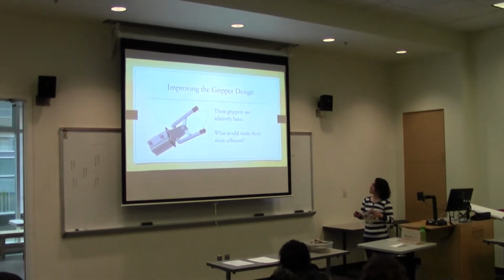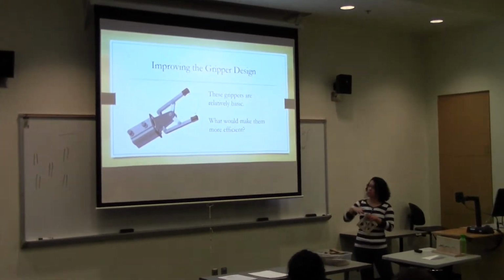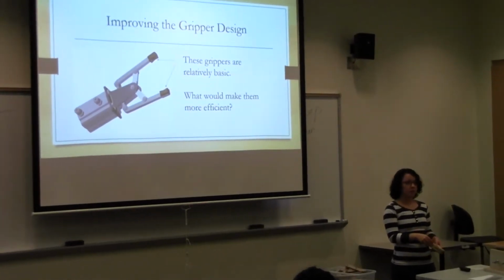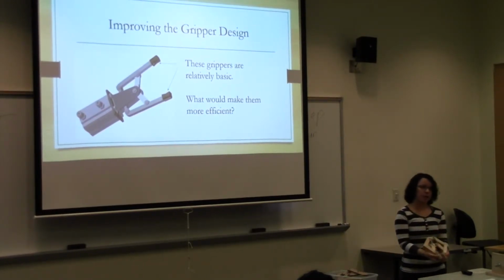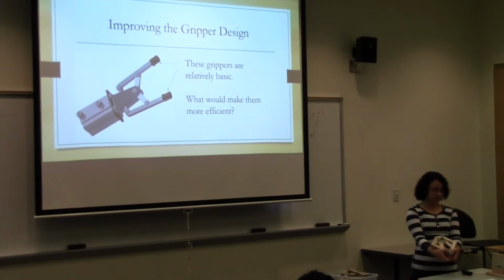And then these grippers that I have here are really basic, kind of like these. That's another thing that you guys want to think of when you start building the device is, what do I want this to look like so it grips everything that I need to grip in the competition effectively.